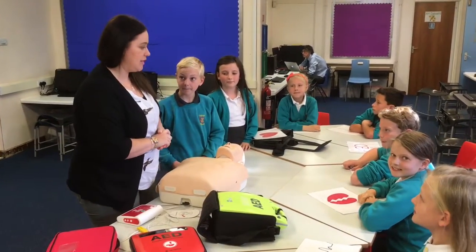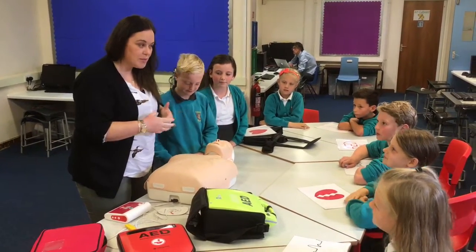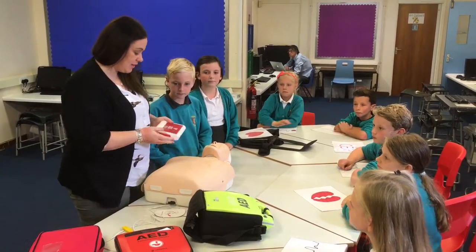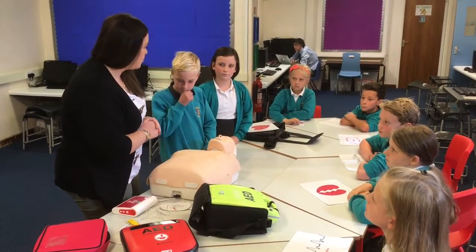The really good thing about the defibrillator is there's only two buttons. There's an on button and there's a shock button. So you open it up, you switch the on button, which is always the green button. This is a training one and it shows us here. And you just do as you're told.